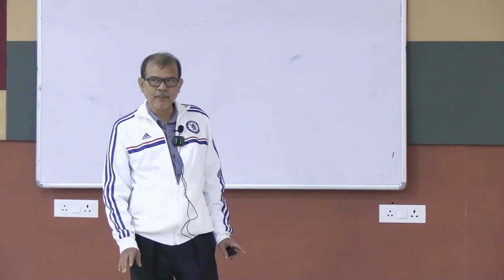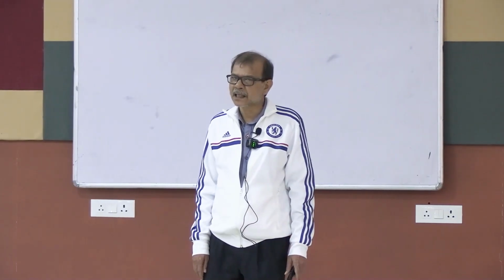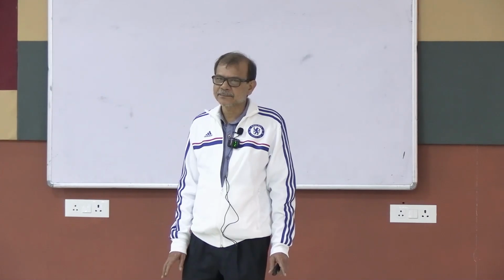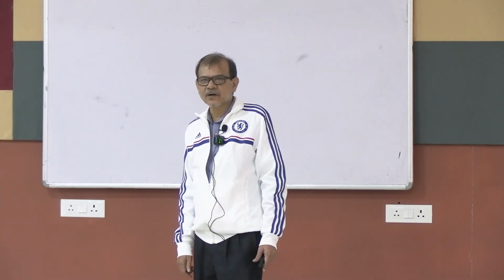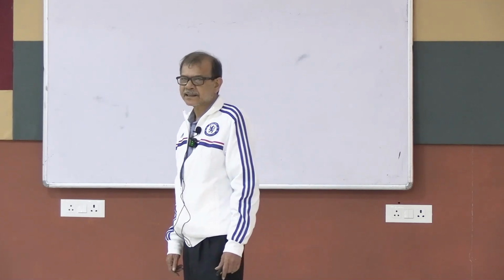So this is the normal P morphology. So focal atrial tachycardia is a regular narrow complex tachycardia with abnormal P morphology. Management is like that of IST, that is inappropriate tachycardia.